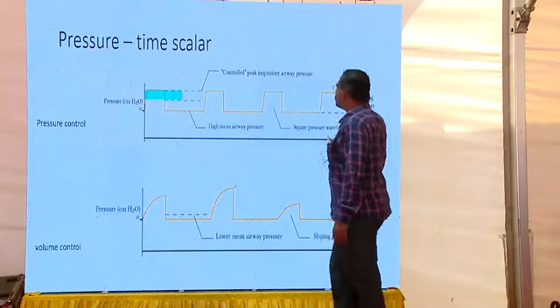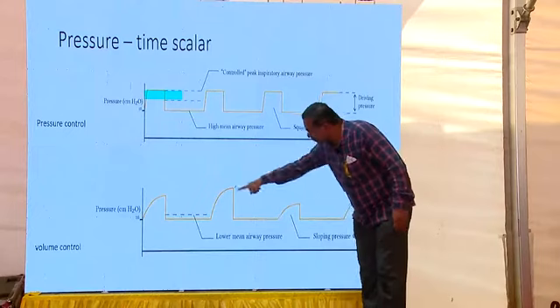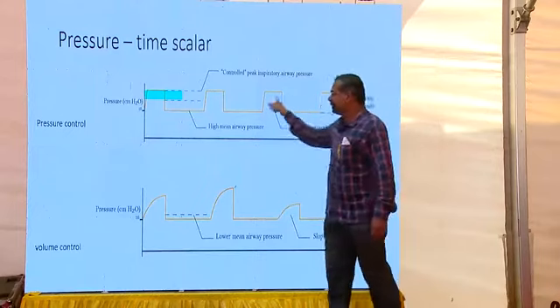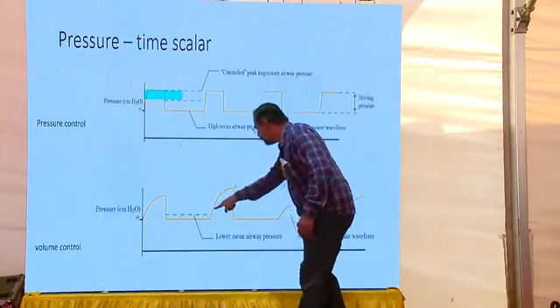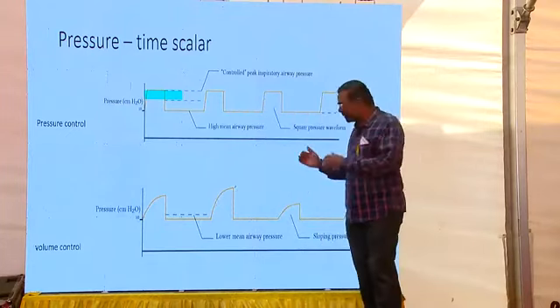So pressure is constant. Pressure is constant. Volume is variable. Volume can change, but this pressure limit is constant. This is typically seen in pressure. Now we can see the square forms, and here there is a slowly rising volume, and it is changing. Now let's compare what happens with volume.